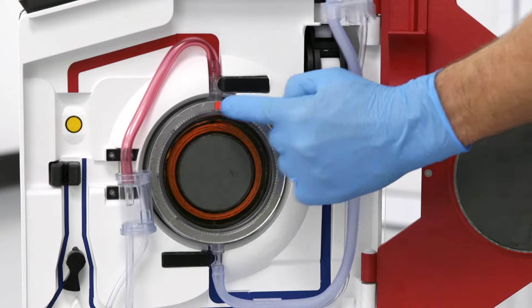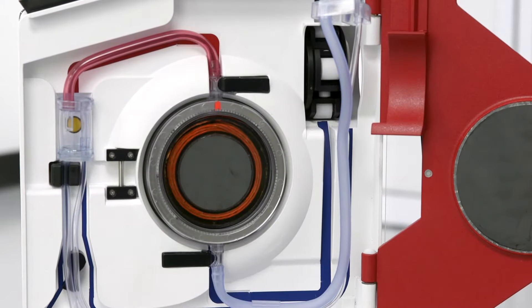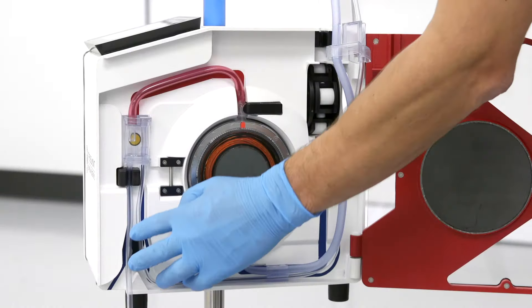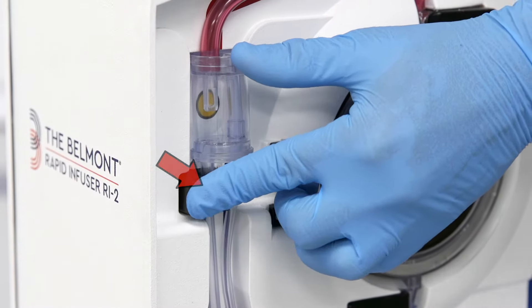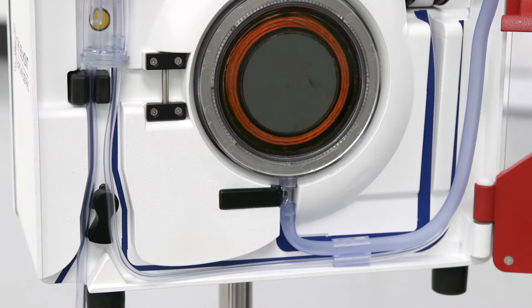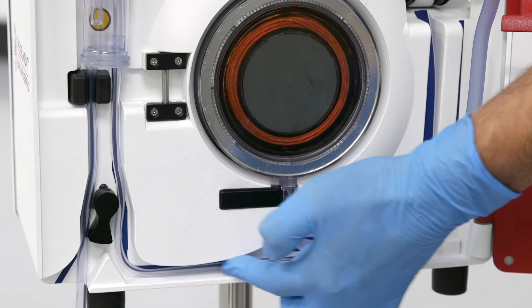Align the red tubing on top of the red stripe and place the pressure chamber into the pressure channel. Press the infuse line into the secondary air detector to the left of the patient safety valve wand. Note: the infuse line should be at or below flush within the air detector.